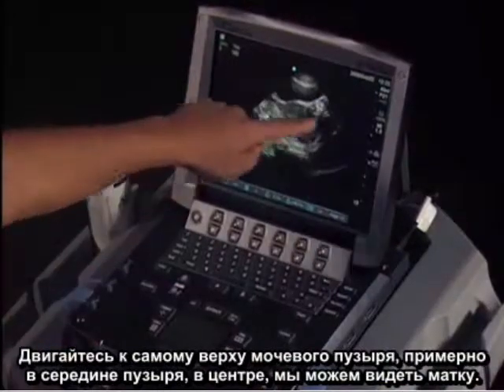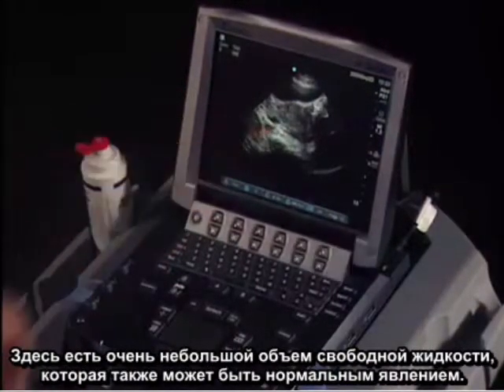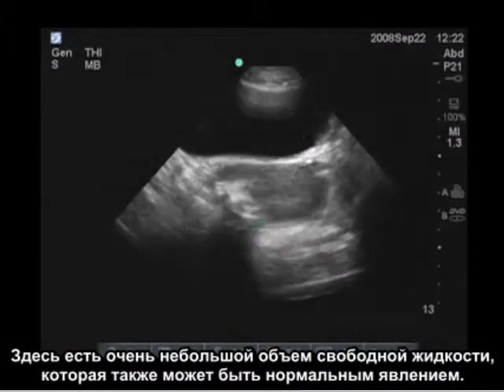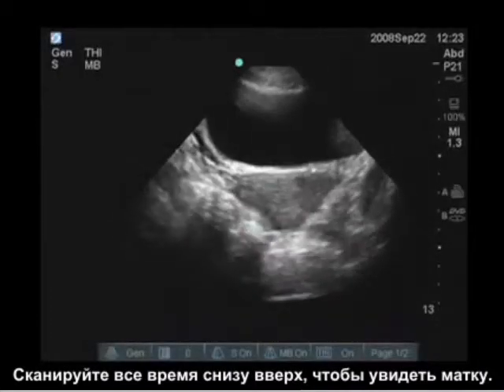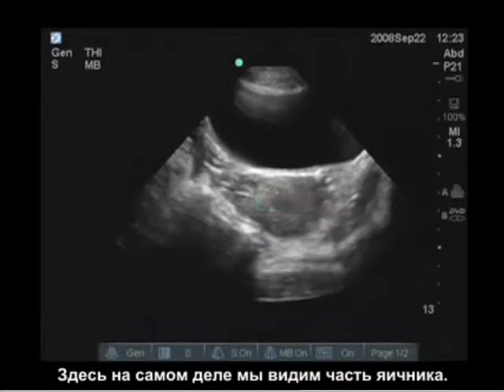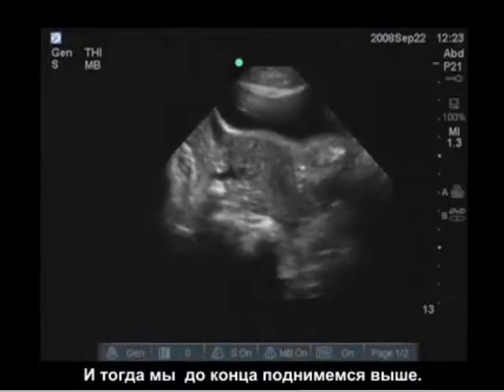We can see the uterus here in the center. A very small amount of free fluid here, which can be physiological as well. So we're scanning all the way inferiorly to more superiorly. We see the uterus. We actually see part of the ovary there. And then we're going to go all the way more superiorly.